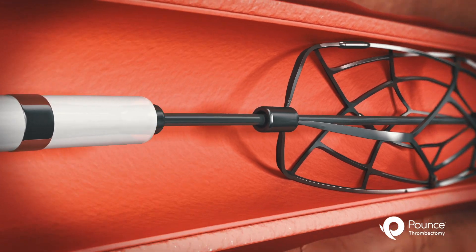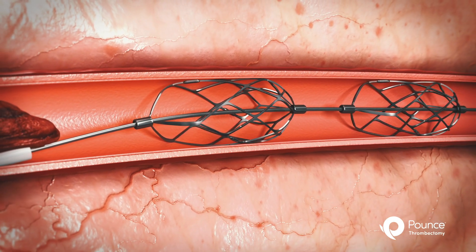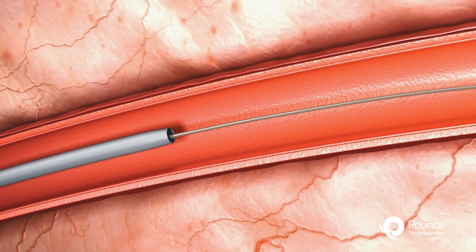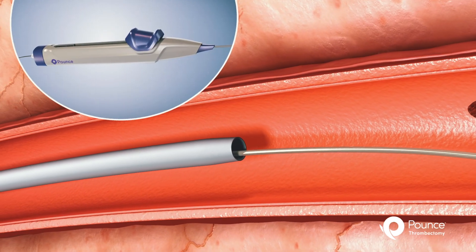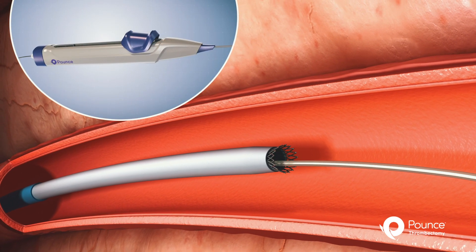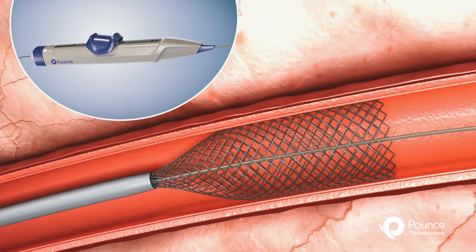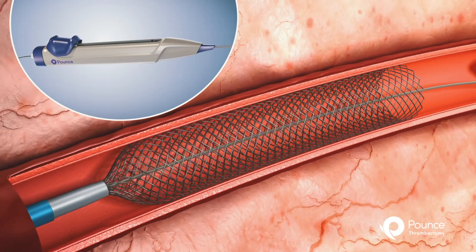While withdrawing the delivery catheter, the dual self-expanding baskets are deployed distal to the clot. The funnel catheter is then inserted into the vasculature and parked proximal to the clot. Using the integrated handle, the physician depresses the slider button and retracts it to the proximal position, thereby unsheathing the funnel and expanding it into place.